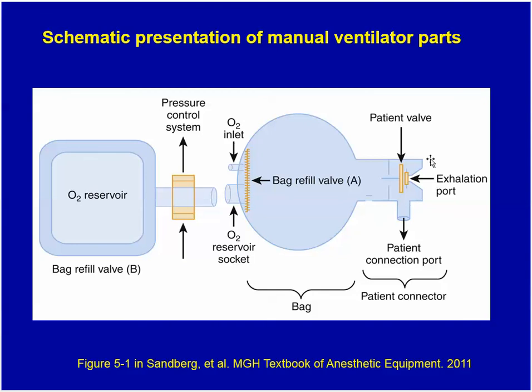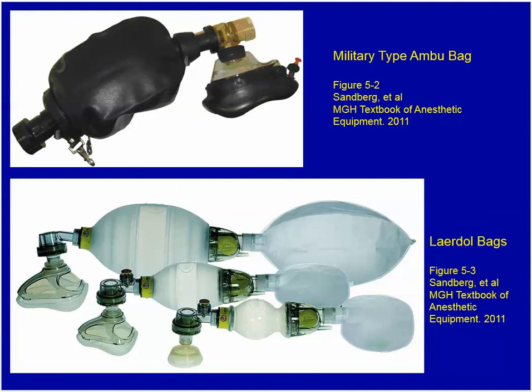This is the valve, which prevents rebreathing, and this is the oxygen reservoir. Oxygen inlet is added to the system here. And here are a couple of pictures of a couple different varieties of these manual breathing bags.